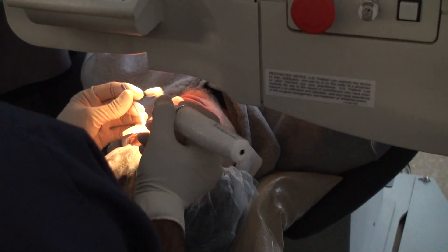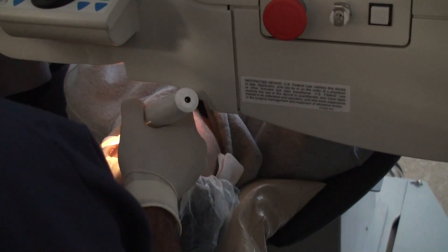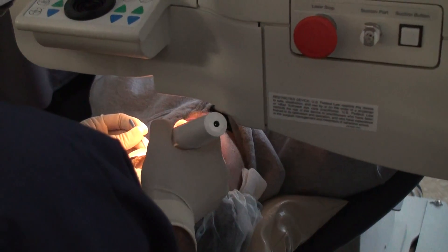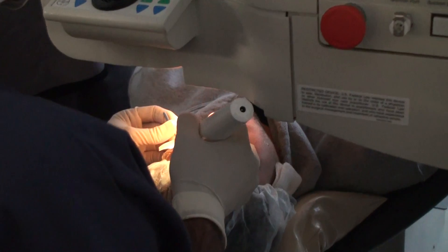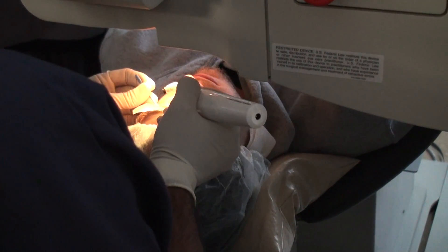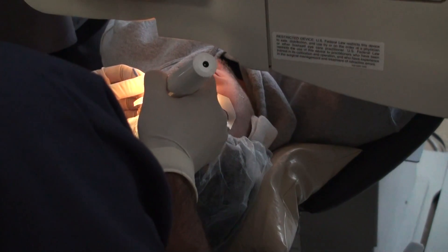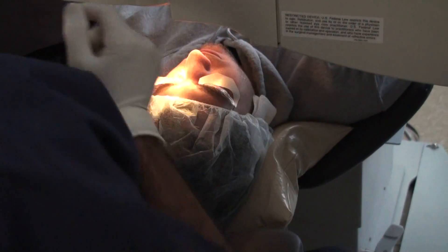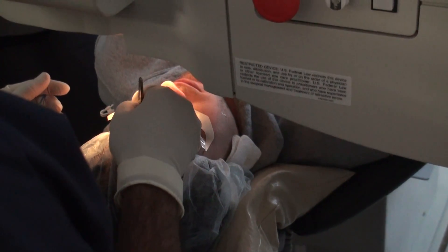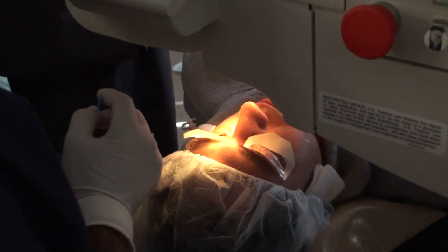Look at the light. I'm going to enlarge the optical zone where the treatment will occur, so it gives exactly how much we need — not more, not less. I'm going to dry everything and get the nozzle in place.